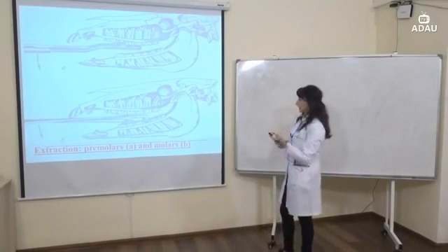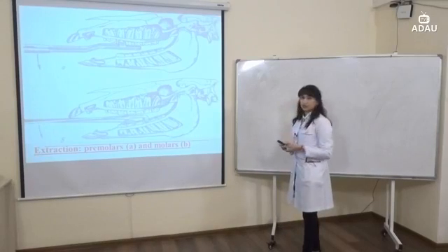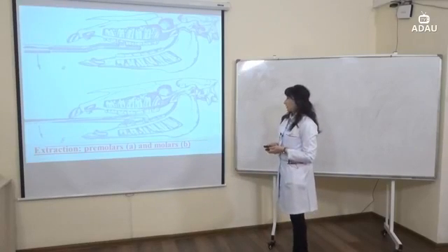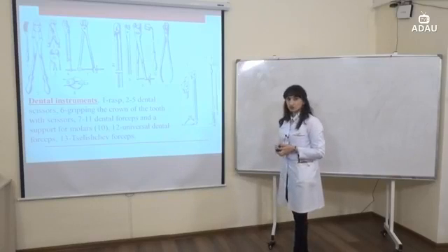This operation in cattle, maybe we use in horses too. About molars. Dental instruments. Which instruments do we choose during this operation?